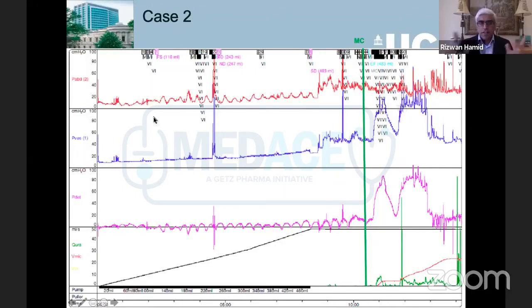Here you can see, again, pattern recognition. Normally, if there's activity in the detrusor line, you say this is detrusor overactivity. Well, nothing is happening in the vesical line. And that is why we put the rectal line in, because you want to find out what's happening in the abdomen. So maybe he's not opened his bowels or he's got irritable bowel. So now you ignore this.